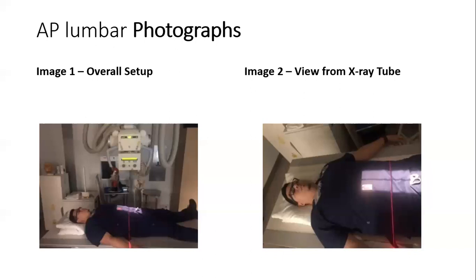When I felt that the patient was in the correct position, I began the exposure. I instructed the patient to remain still and hold their breath for the length of time that it would take for me to complete this exposure.